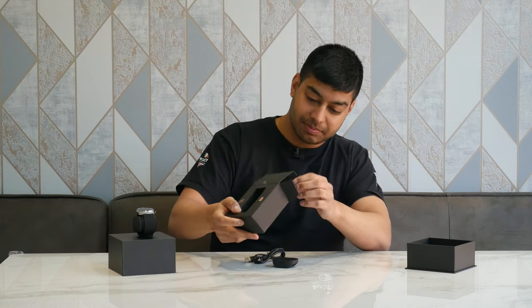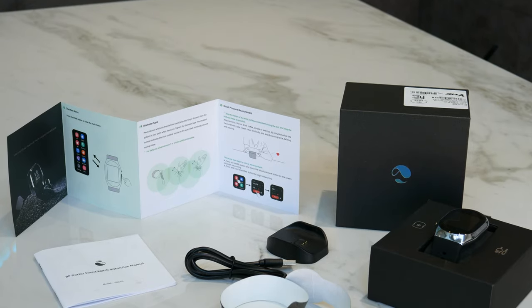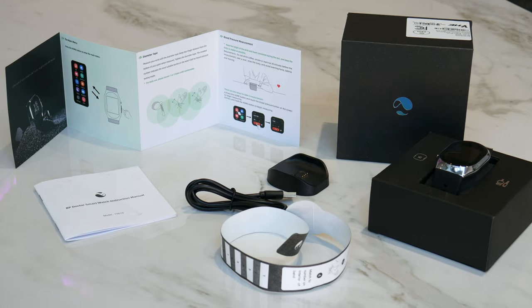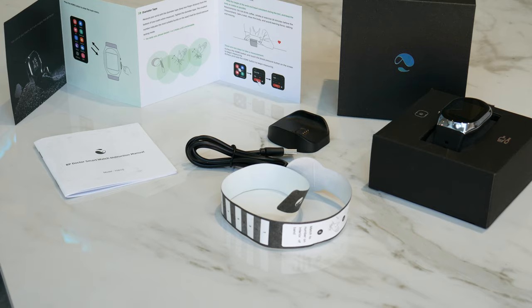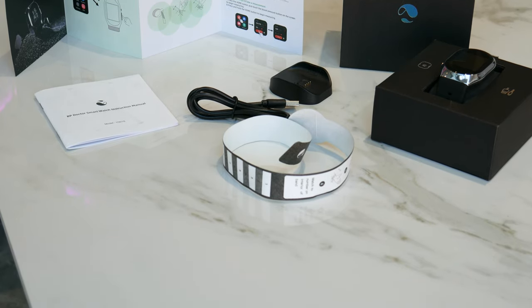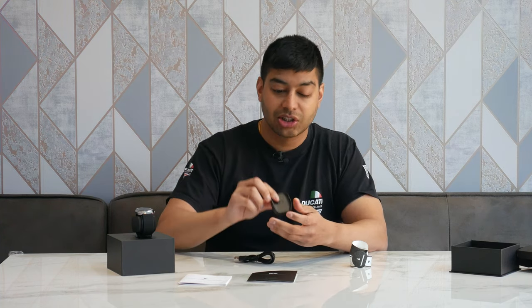Open it up and see what we get. The first thing is the BP Doctor smartwatch instruction manual — a guide covering all the features and how to use the smart monitor. You've also got a quick start guide in full colour covering initial setup and how to take your blood pressure reading. Then you've got your charging dock.